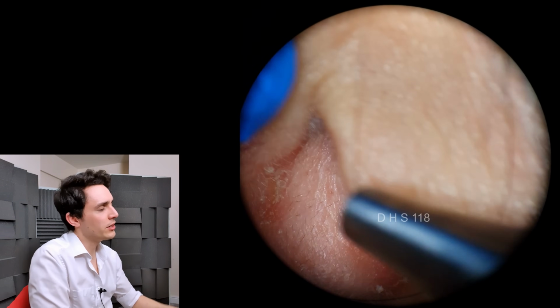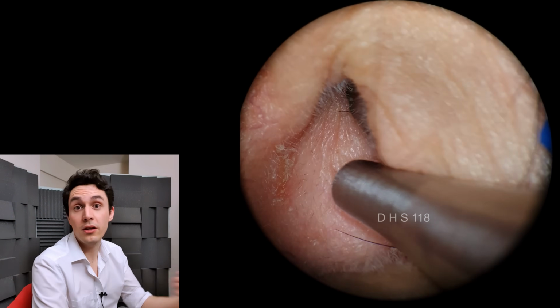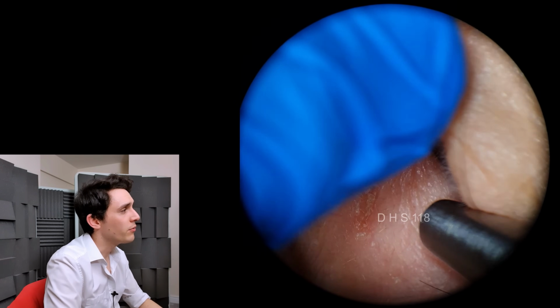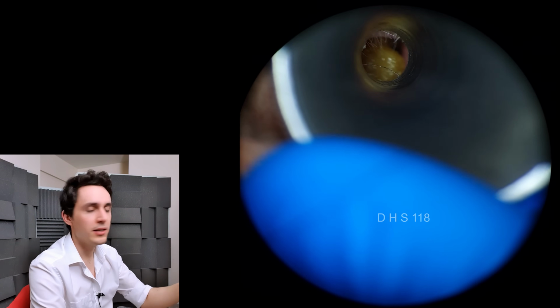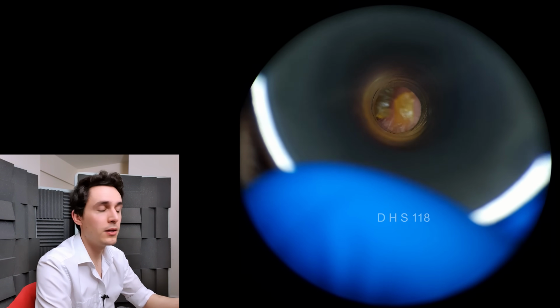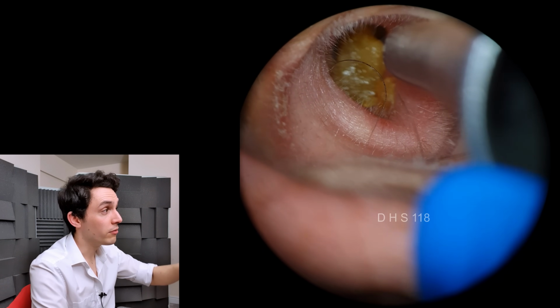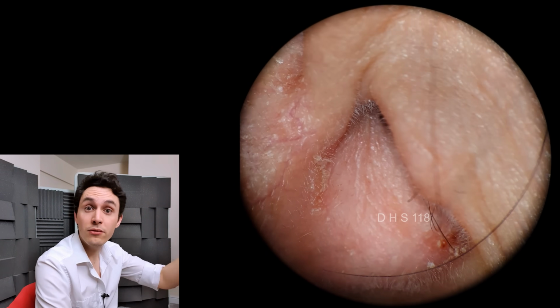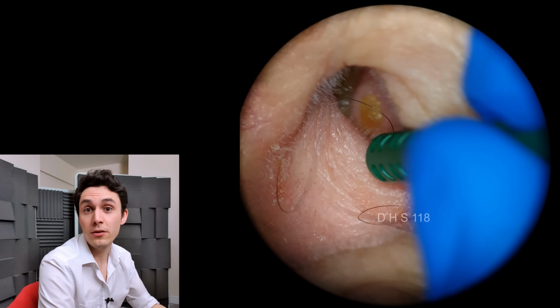In this next case, I'm going to use a combination of the Earway Pro and then suction at the end. Initially, this outer layer of wax is a little bit hard, a little bit crusty. So I'm going to very quickly go in and use a large one to retrieve that outer crust. Then I'm going to go in and get the deeper stuff with the suction.